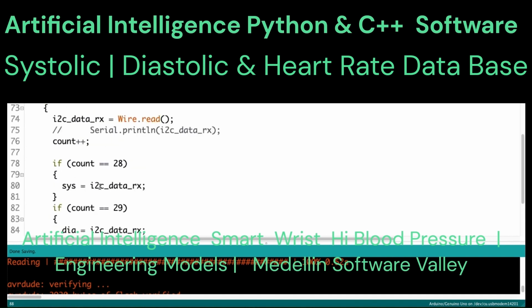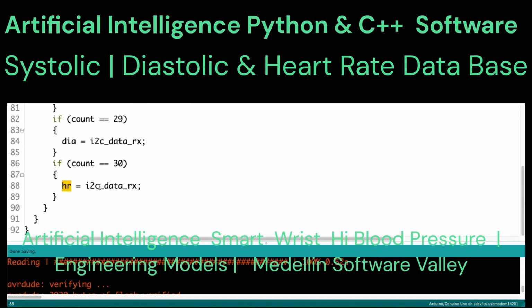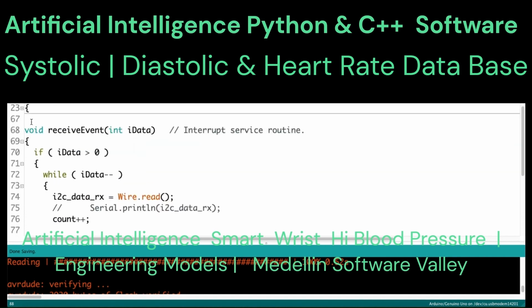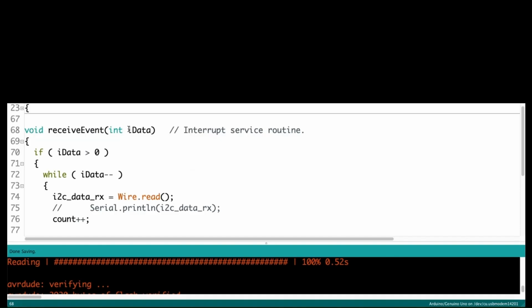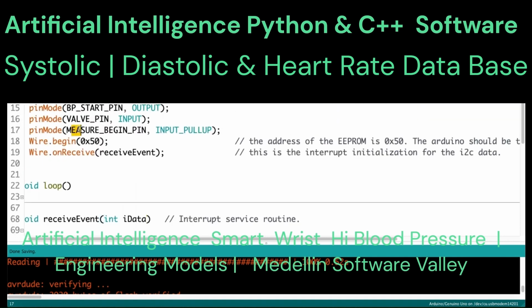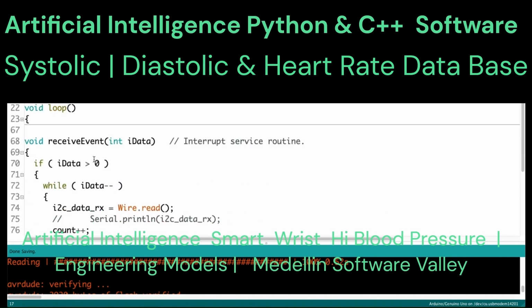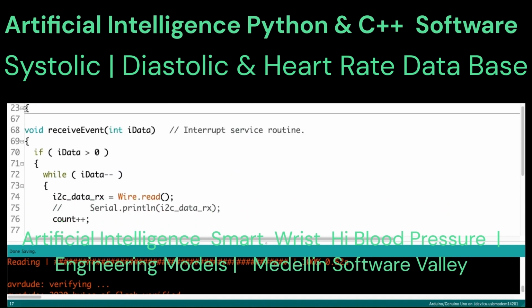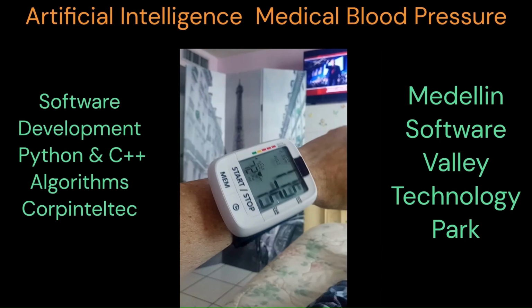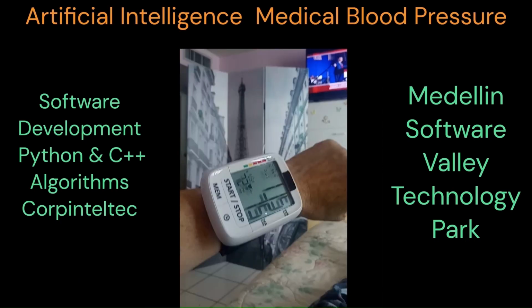First, the low pass and shock filters were used to pre-treat the ambulatory blood pressure and extract the features, followed by pattern analysis performed through logistic regression analysis based on the classification of the initial clinician of the training data.